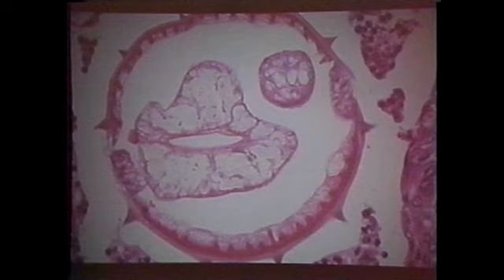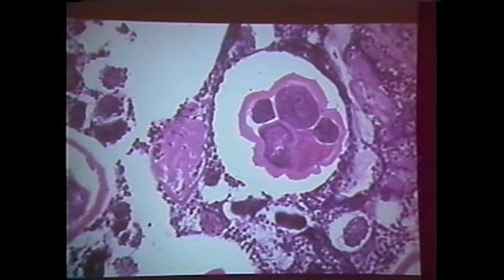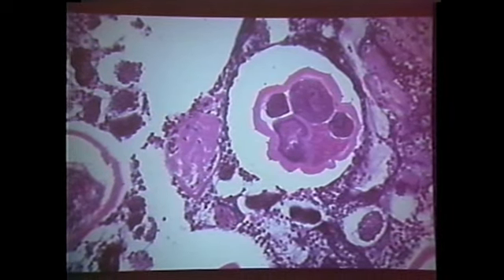Now, let's go to trichostrongyles. This is not a very good one, this muscle is a little bit different, so let's not dwell on it. But the intestine is large. You don't see many cells in it, so it's large, composed of few multinucleated cells. But what most trichostrongyles have are external longitudinal ridges. Look at them. They're sticking out like that, huh? And this is a cross-section, so it has to be going the length of the worm.